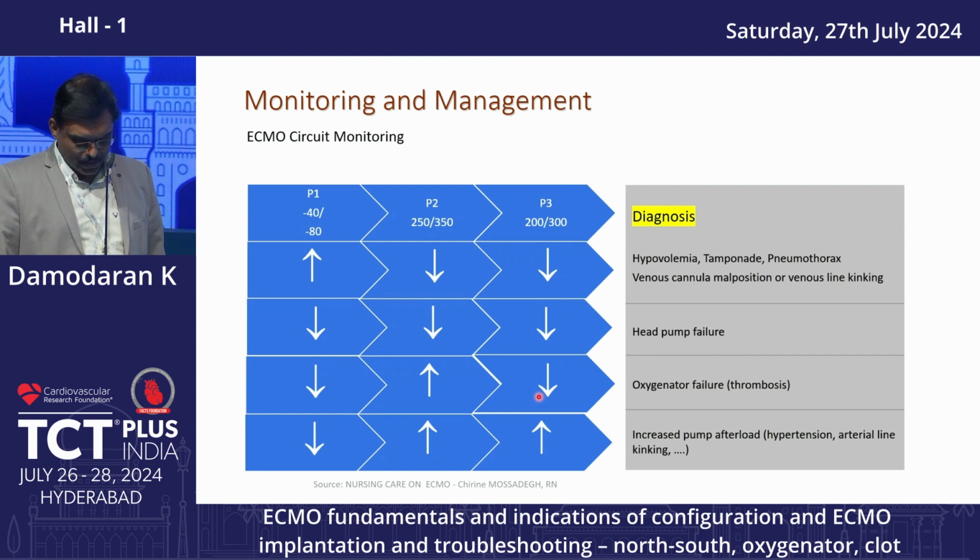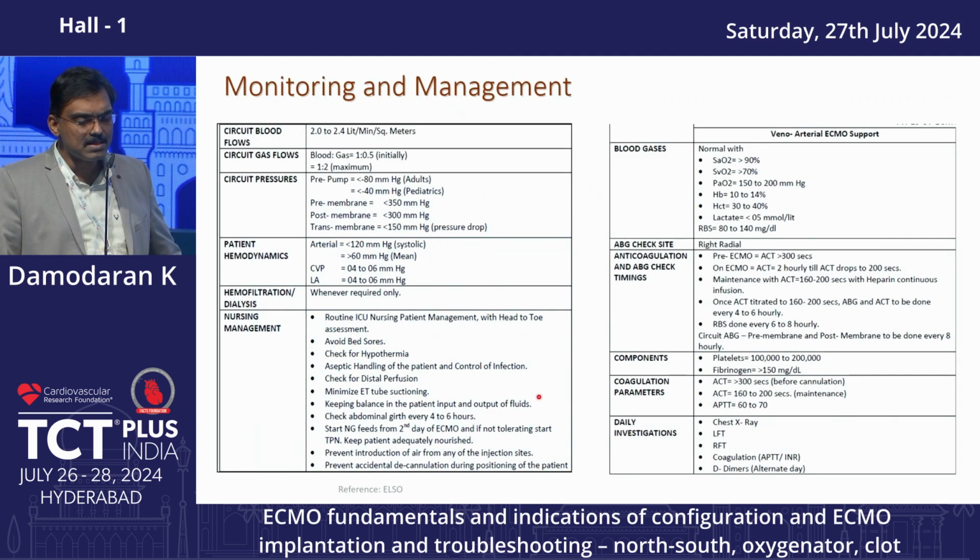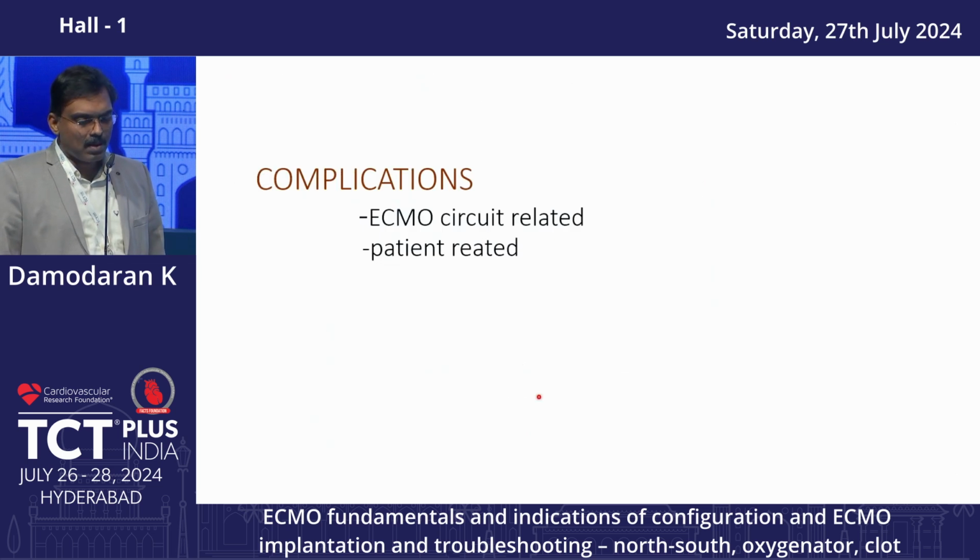So these things, whenever you are managing ECMO, this chart is very essential to remember, and you can see this with the help of your intensivist. And this is a very busy slide just to show you the various things you have to monitor, starting from the coagulation profile, circuit, hemodynamics, nursing care, etc.